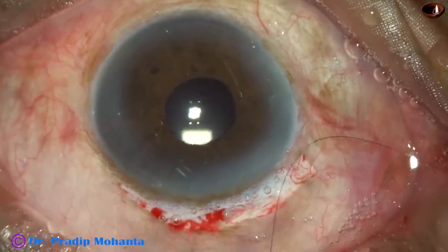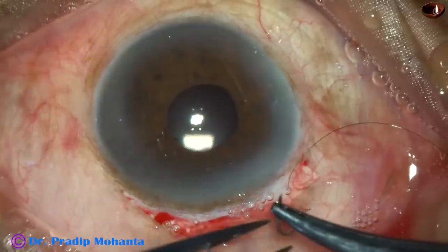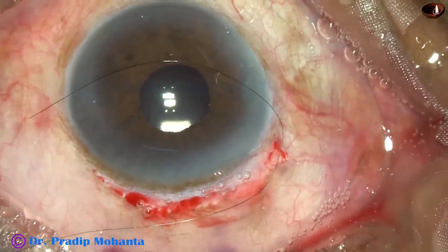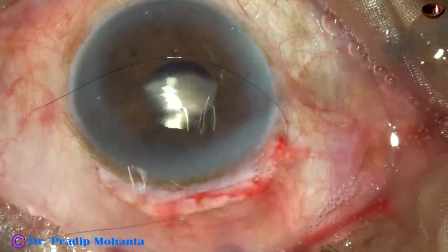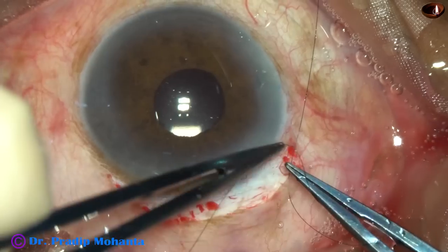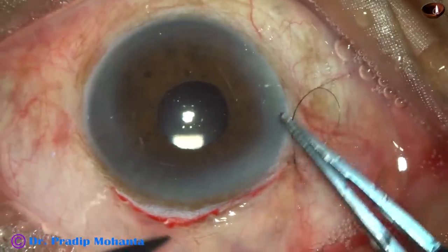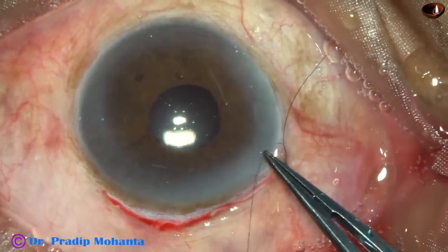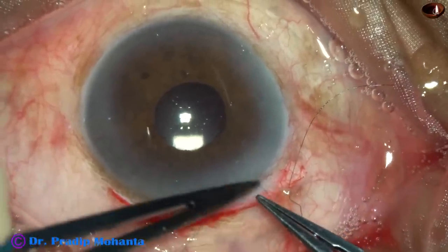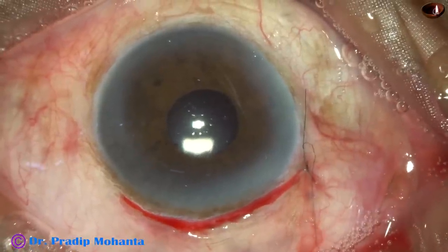I usually prefer to use a releasable suture for apposition of conjunctiva to the limbus. Take McPherson's in your right hand and a straight suture tying forceps in your left hand. Make three loops and just pull it — one, two, three loops. Hold it here, pull it, then cut here. When you pull this thread in the OPD it will come out — this is the releasable suture. Pull and trim the thread with the needle; trim the other thread also but keep it longer than the previous one.